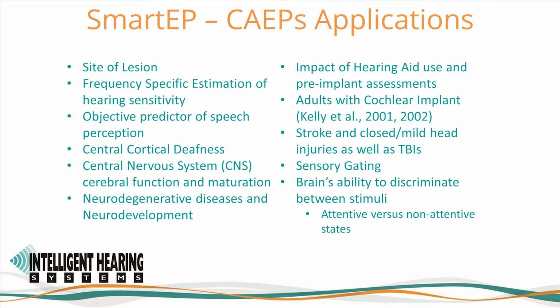There are many reasons why you would want to acquire cortical evoked potentials. For starters, CAEPs provide neurodiagnostic perspective across lesion types. Site of lesion testing is important because when combined with ABR, a clinician can differentiate brainstem from thalamocortical involvement.